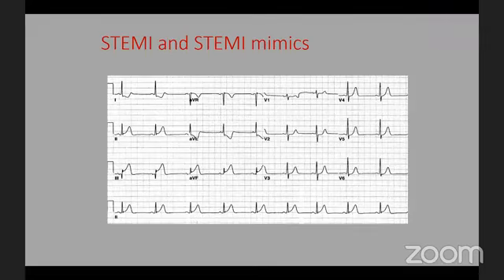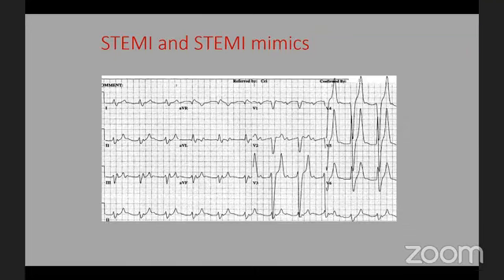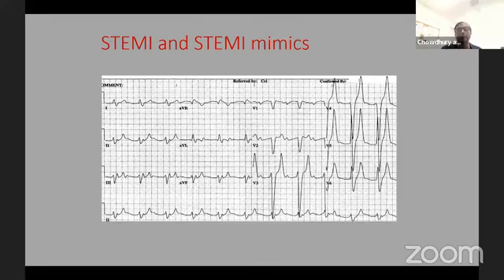So what is this one? Why not potassium, sir? It is hyperkalemia. Yes, absolutely. Possible hyperkalemia. And Tushar got it right because he's more experienced. But I'm saying, if you cannot get this right away, then ask yourself, how is the patient presenting? Lethargy, and then diabetes, hypertension, clinical history. Talk to the patient, talk to the family. Find out how the patient is presenting, and then correlate with the EKG rather than getting anxious.